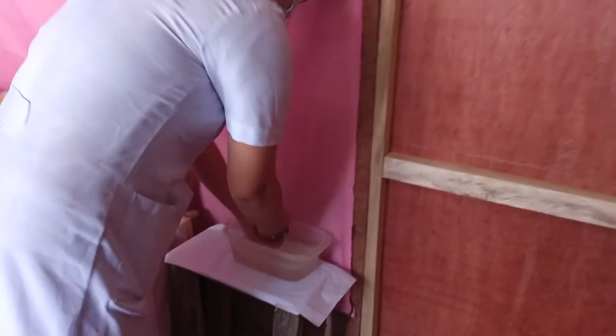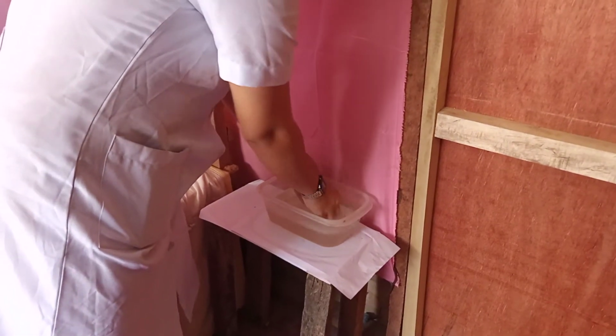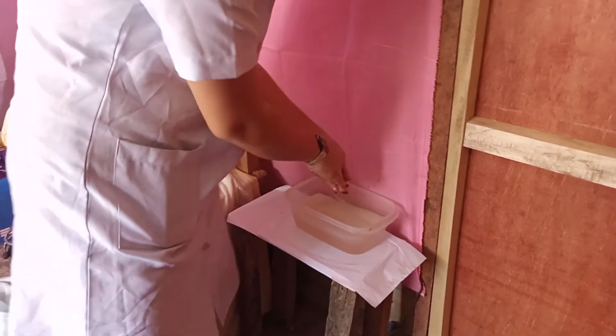After that, wash hands to prevent the transmission of microorganisms. Then, evaluation. Next procedure is evaluation. So, evaluate the level of blood pressure. Rationale: to compare with the baseline data.